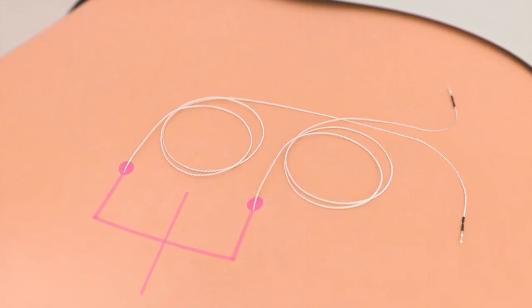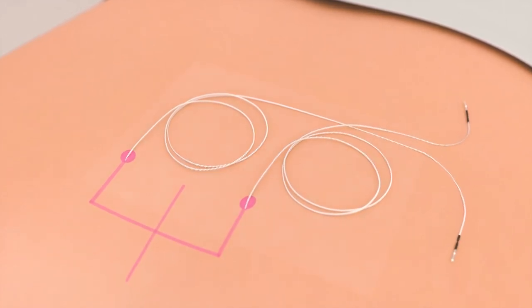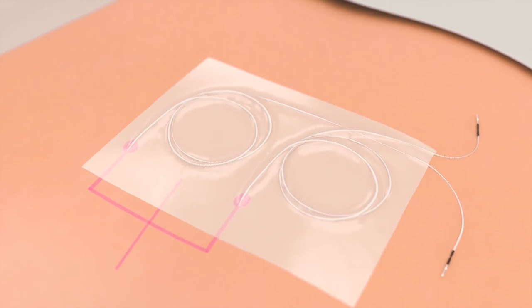Each PNE lead is coiled above its respective insertion site and covered with gauze and a small tegaderm, leaving enough excess for the basic trial cable connection.